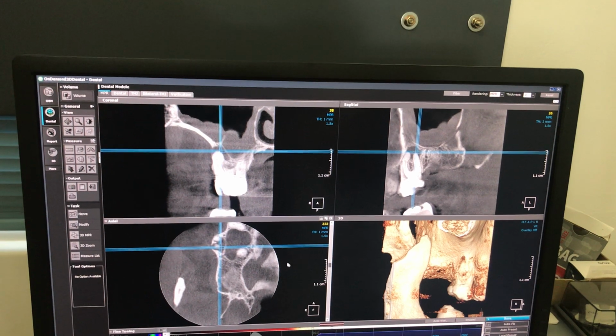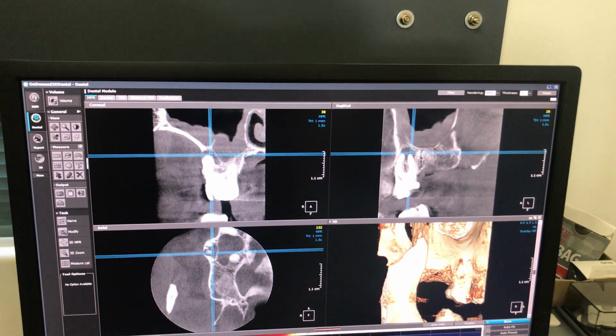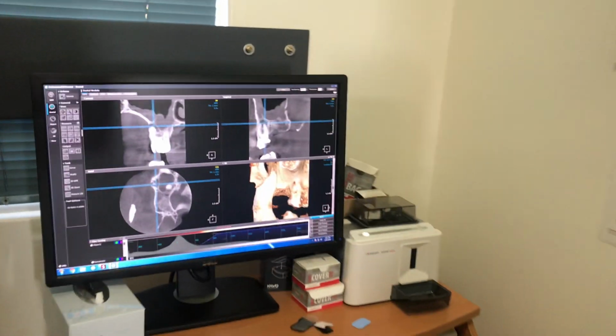The practitioner can really get value out of these three views, and the patient very rapidly understood the level of severity of damage. Fantastic. Yeah, so having the system in-house, obviously compared to years ago, allows you to have a really smart workflow, from not referring the patient out to being able to do it here and now, do a treatment plan and get a treatment plan acceptance.